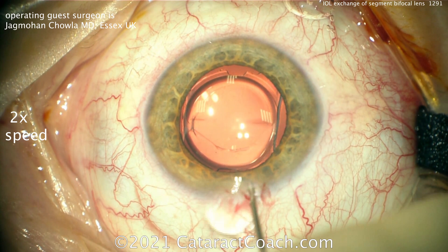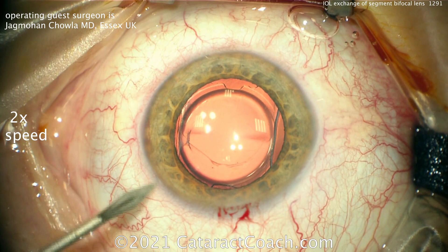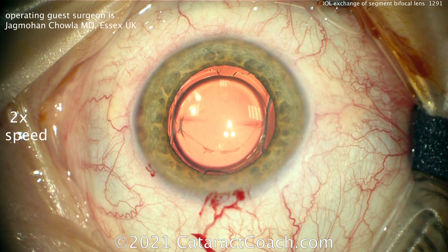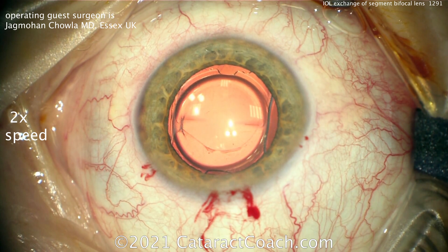The patient said, 'I cannot live with this lens, and I absolutely want to exchange for just a straight monofocal lens aimed for plano.' So first things first: fill with viscoelastic, and now you've got to carefully dissect out that IOL. You don't want to damage the capsular bag. We've sped up the video — it's two times normal speed — just so we can get through the whole case.